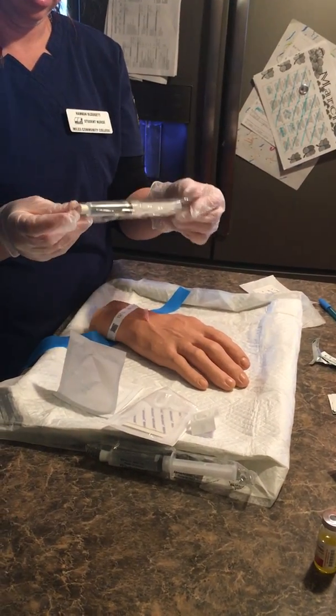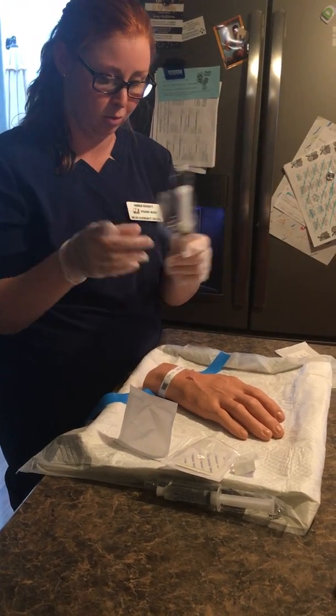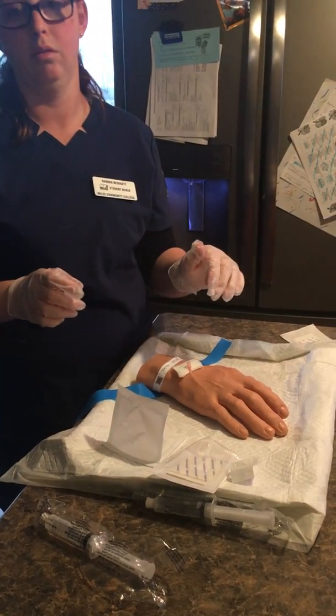And then I can go ahead and, what am I doing? Flush. Make sure that, no, not flushing. I'm gonna go ahead and do this first. Can we pause?